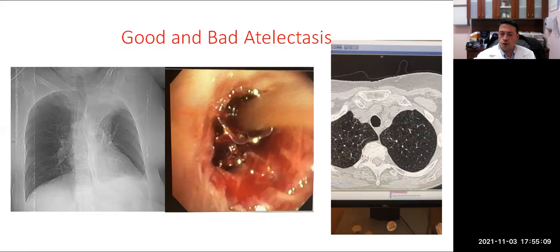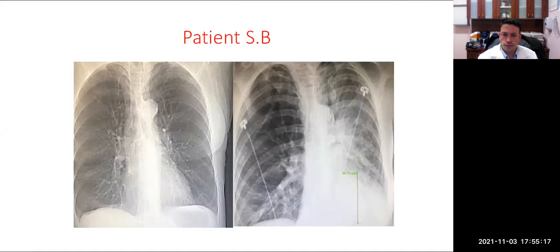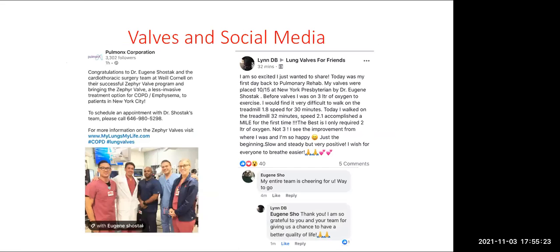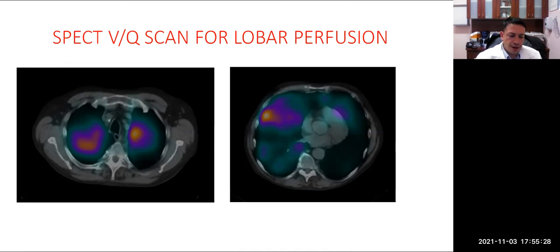It's usually going to be also accompanied by classic signs of post-obstructive pneumonia. Do you think the reason for that was that there was something wrong with the valve? Yeah, trying to remember the specifics of the case. It was a long time ago. I think it had to do with the positioning of one of the valves that I thought maybe was okay, but probably in retrospect I was wrong, and that valve needed to be repositioned.